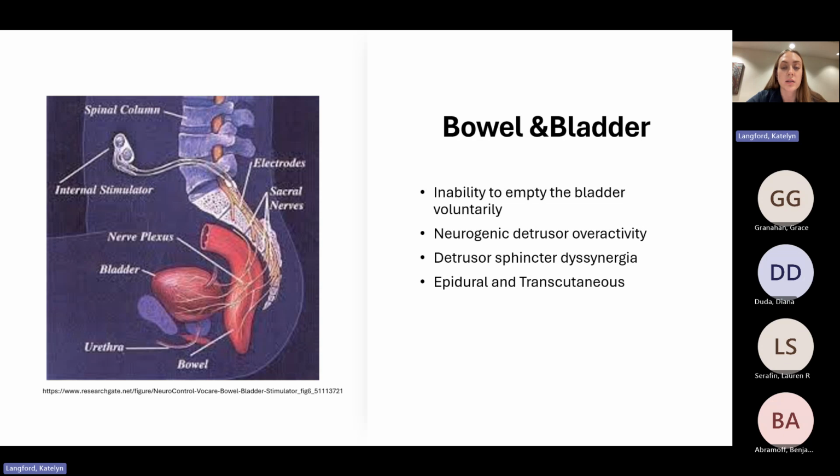So some of these devices that are available, the Finetech-Brindley system, that's a sacral anterior root stim. This is an e-stim controlled by an implantable pacemaker-like device that drives bladder and urethral sphincter contraction. This specific device allows patterns that can empty the bladder, like in spurts, so it's mimicking your own physiologic voiding. This device can improve quality of life.